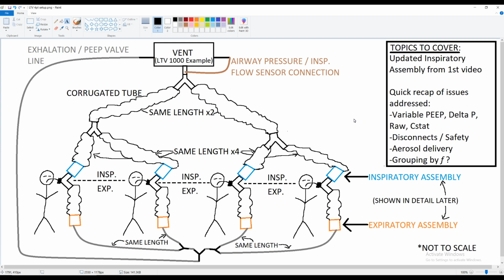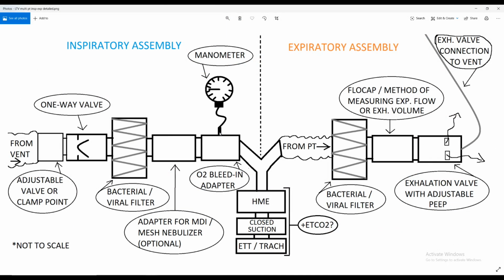So what is the big deal about having that little ball valve or having the clamp point or some sort of adjustable valve in the inspiratory assembly here? What that's going to do is allow us to have control over what pressures actually get delivered to the patient's airway. So we already said, just to recap, we're measuring the patient's airway pressure right here, as close to the patient as we can on the inspiratory side, preferably right at the Y adapter, using a little O2 bleed-in adapter with a manometer so we know what pressure is reaching the patient. Well, up until this point, without the addition of some sort of control valve or clamping, the patient was just getting whatever pressure the machine was set at.